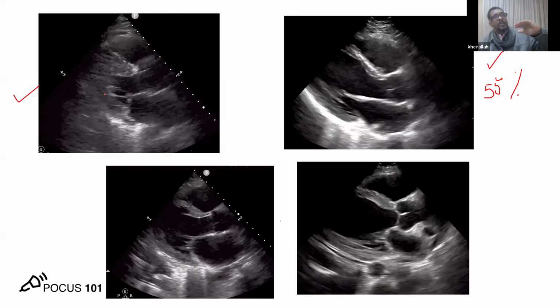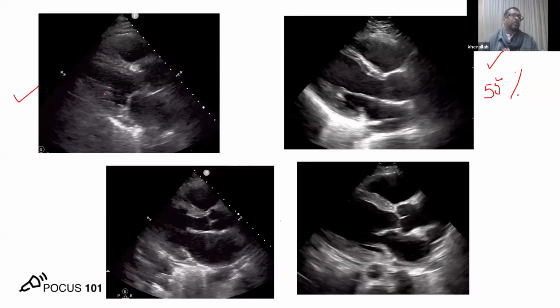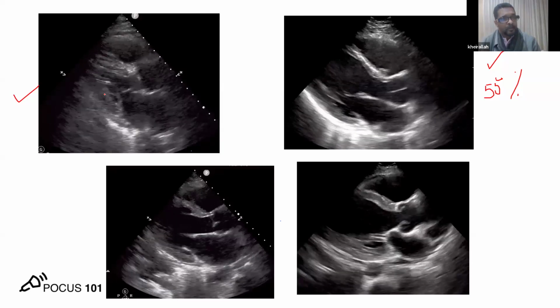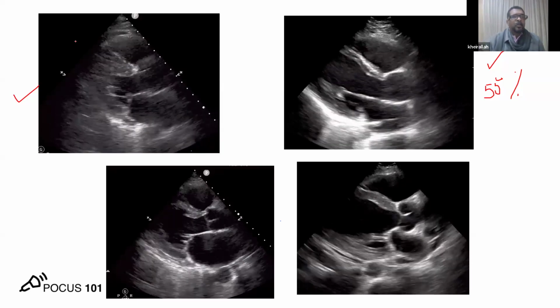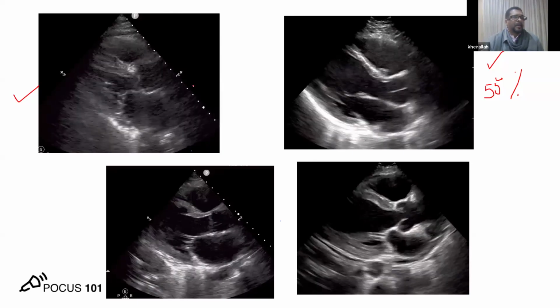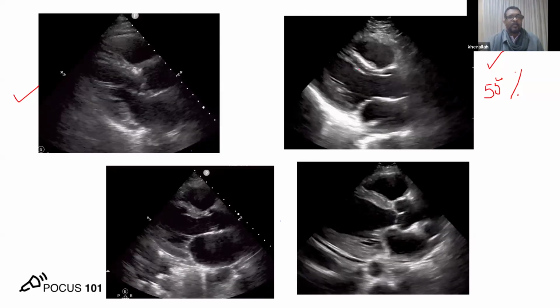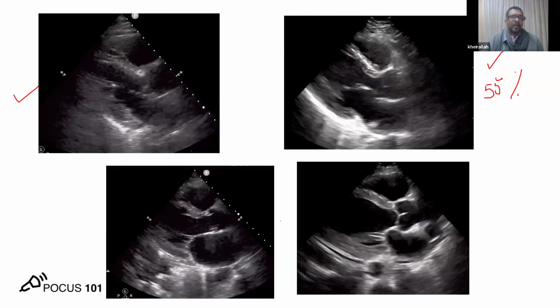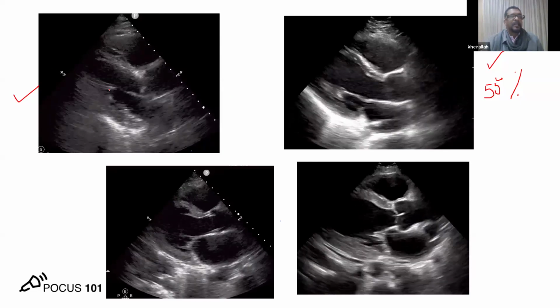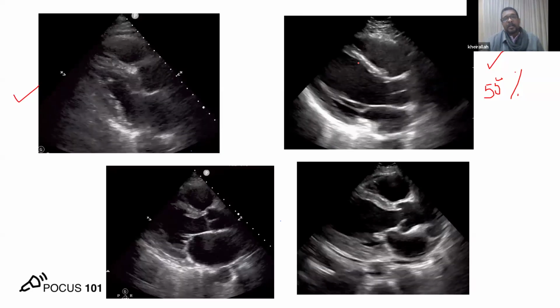So the more you go north in ejection fraction, things are not good, by the way. When you get an ejection fraction of 70, 80, 90, that's not good news. That's why it is important that the hyperdynamic heart is not as good as it's thought to be. You have to have a relaxed heart with an ejection fraction of 55, and there is always a cavity. Obliteration of this cavity due to hyperdynamic hypercontractility is not good. So this is hyperdynamic, this is normal.